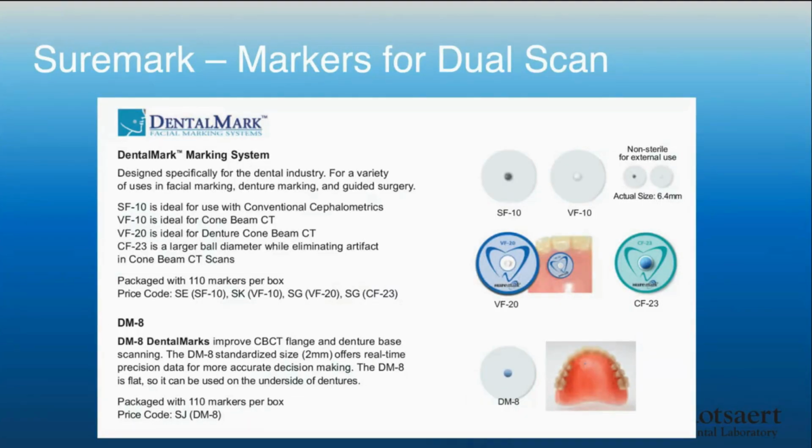I think Henry Schein has these. Patterson does as well. But it's just a tape on a roll, and you peel them off, you stick them in. They're for other medical procedures as well. There's varying types that are done, but it's really just to give you that alignment, right?